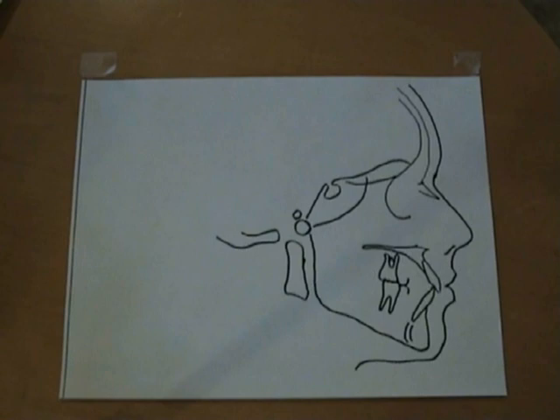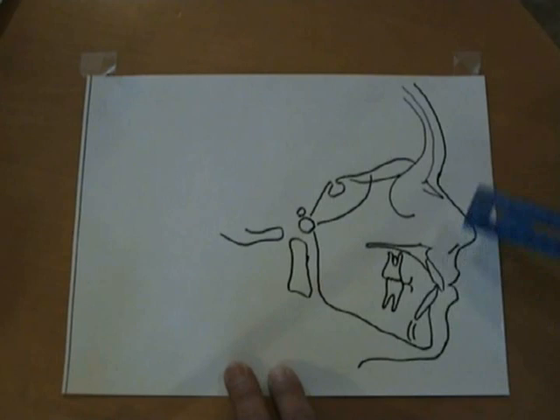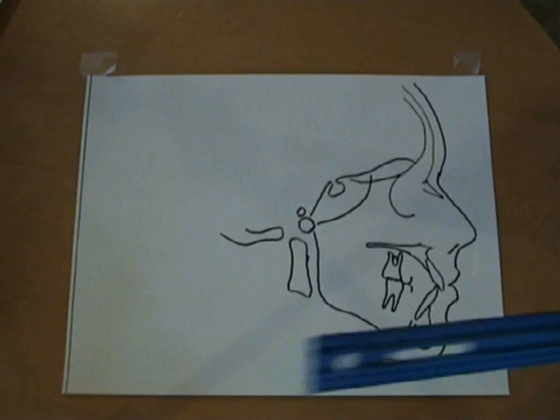Once I trace the cephalometric analysis on the acetate, I will take the acetate and take it to a copier machine and make a copy. And this is what I have. I find that this is so much easier to do the analysis than on the acetate or the radiographic tracing paper.